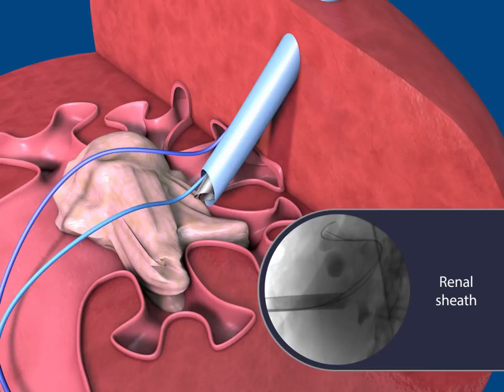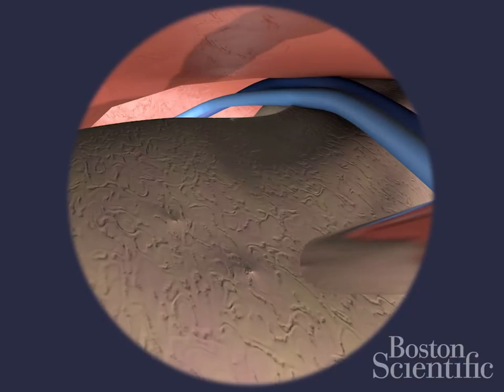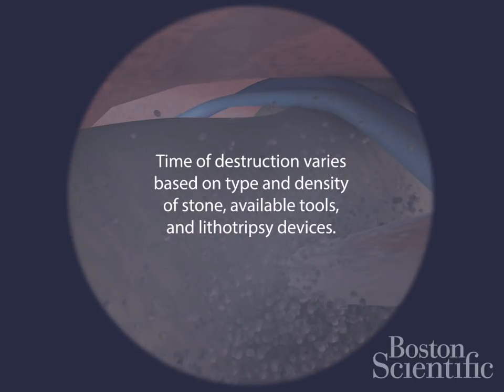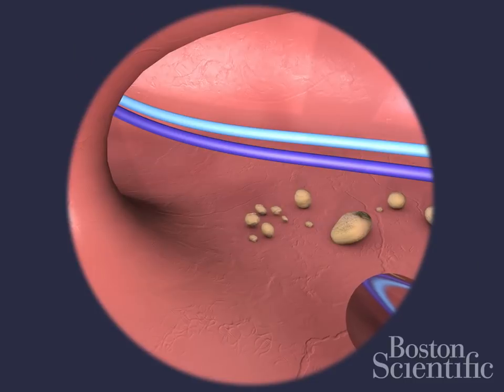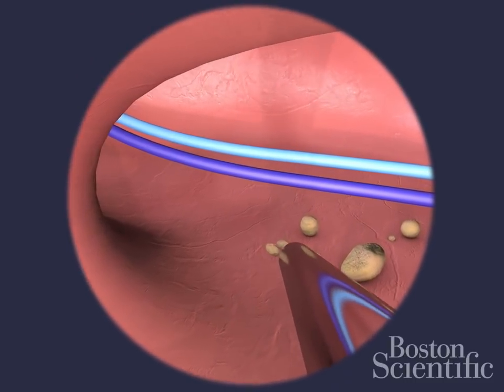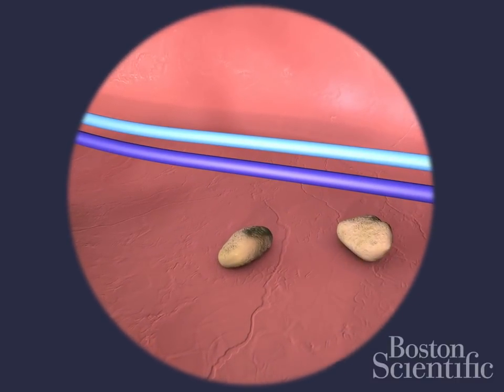Insert the nephroscope into the sheath. Guide the pneumatic and ultrasonic lithotriptor through the working channel of the nephroscope. Perform lithotripsy to break up the stone. The time of destruction varies based on the type and density of stone, available tools and lithotripsy devices. Irrigate and remove smaller stones using the lithotripsy probe. Remove the lithotripsy probe.